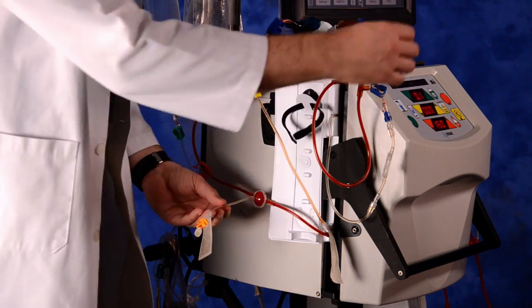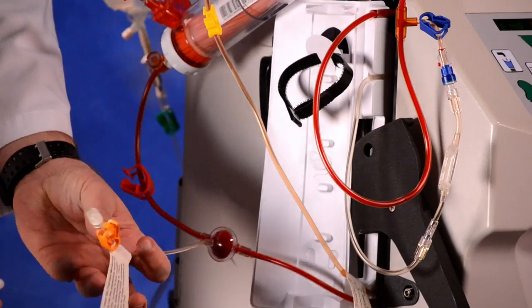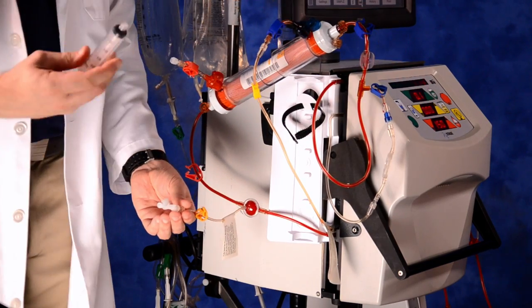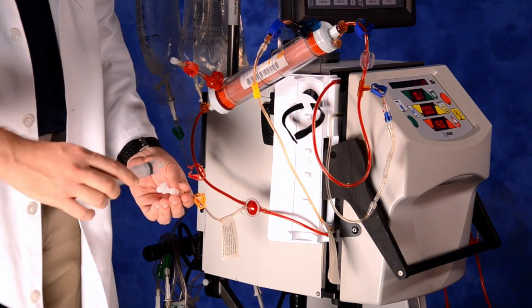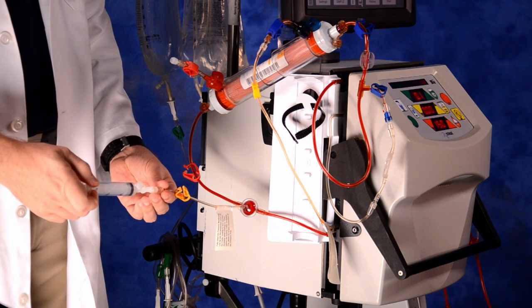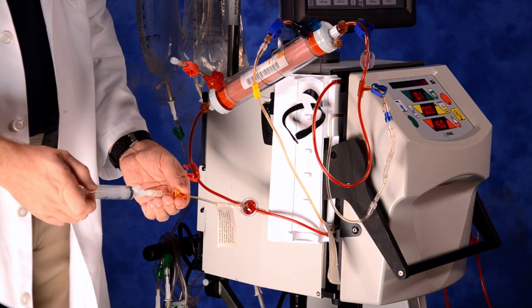Connect a female-female connector to the filter pressure monitoring line and then attach a syringe to the adapter. Inject approximately 3 cc's of air into the filter pressure monitoring line to bottom out the filter pressure pod. Clamp the filter pressure monitoring line orange clamp.